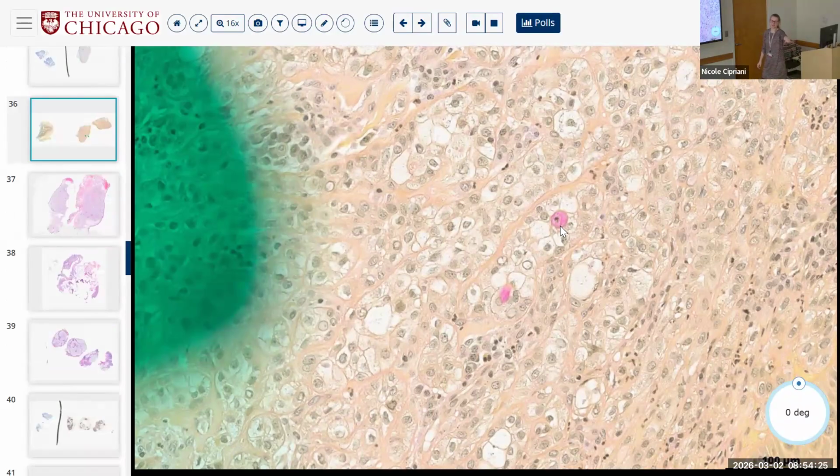Who wants to place a bet? I already owe people beers on Wednesday, so solid mucoep. We've got to vote for solid mucoep. Mucoep. Highlighting hyalinizing clear cell. We already know what your vote is because you already said it. Mucoep. Yeah, I'm going to say mucoep. All right.